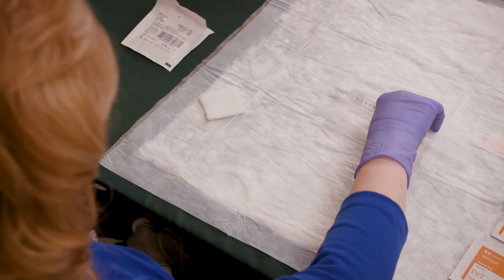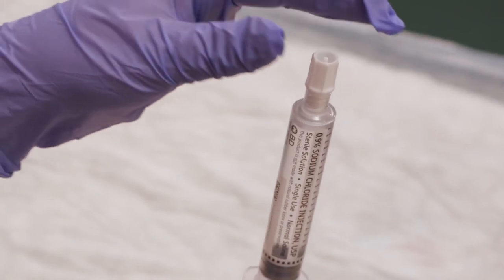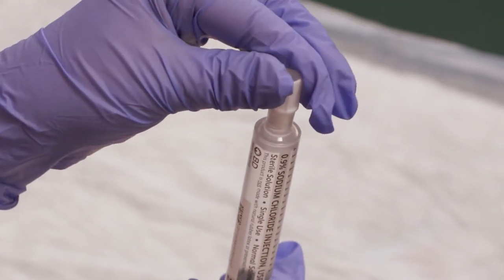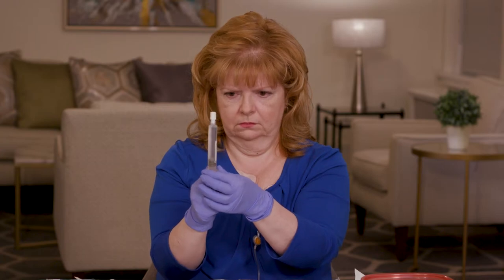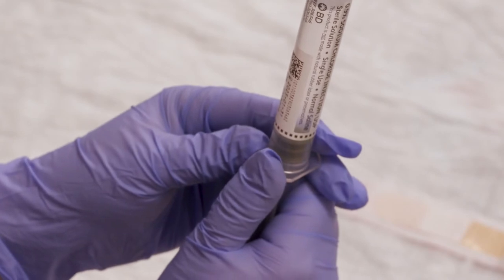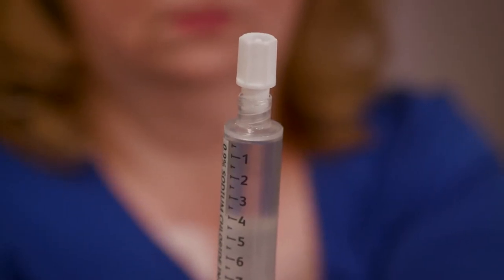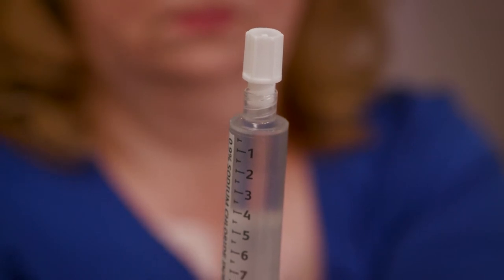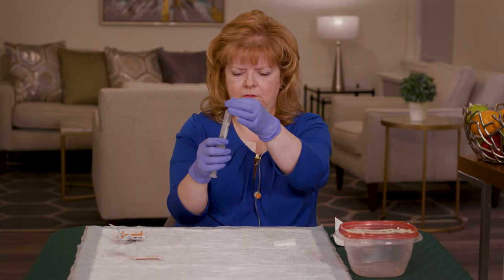Pick up the pre-filled syringe. Point the tip up and loosen, but don't remove the cap. Pull the plunger back slightly, then gently press it up until the air bubble is pushed out. Retighten the cap and set the syringe down.